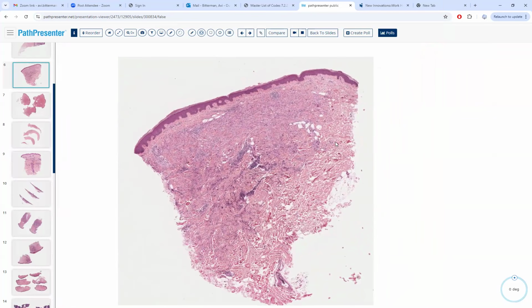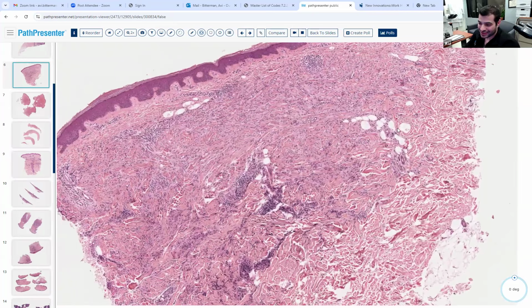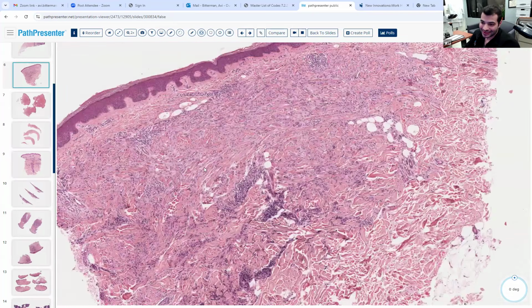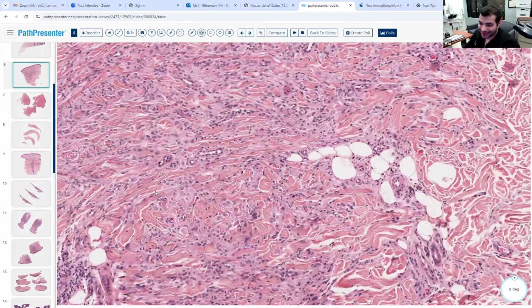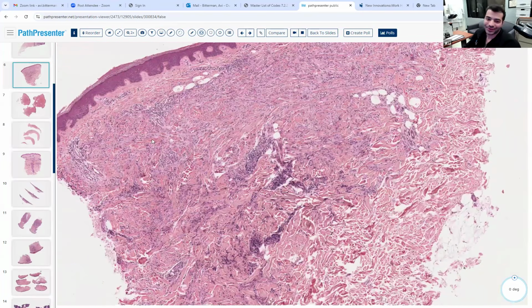And why is it not NLD? It's not so layered. There's no pattern to it. It just seems diffused throughout. Yeah, just a patchy diffuse infiltrate. You can see that it's not top to bottom, side to side. Mucin also goes against NLD. Good. Okay. It's recognizing interstitial GAs. Excellent.